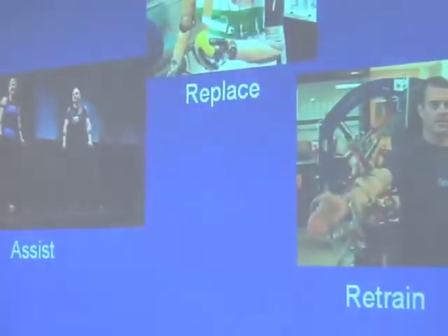And then the area I've worked in mainly is in robotic devices for retraining movement. And remember, we had this picture of the occupational therapist helping the man with his hand exercise. So we build exoskeletons that look like this. This is for Professor Jim Bobro. Steve Spencer is a PhD student. I love the video because every time he turns up the speed of the robot, he smiles. So you can see he's really confident in his programming and safety mechanisms here. We don't do that to patients, but that just shows you. So he's just relaxed, and the robot's moving here. Okay, so I'll tell you the story about that robot in a second. It's called Bones.